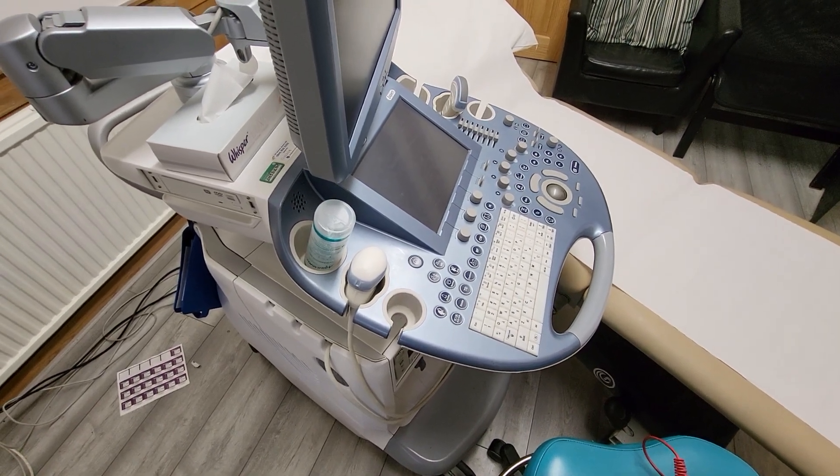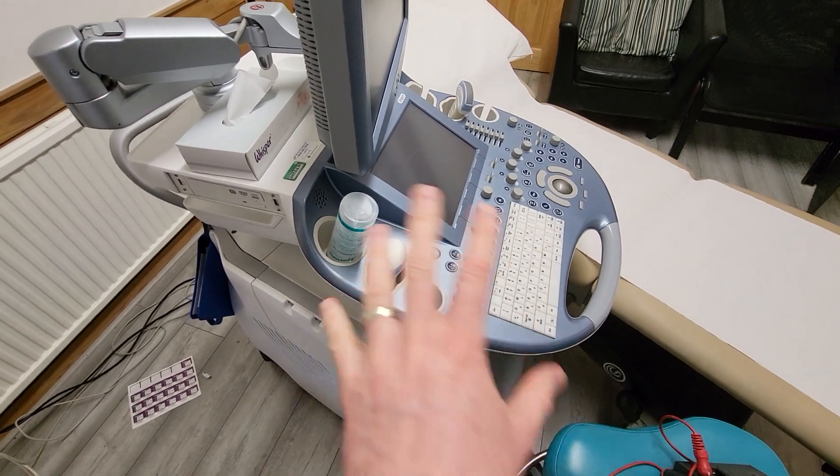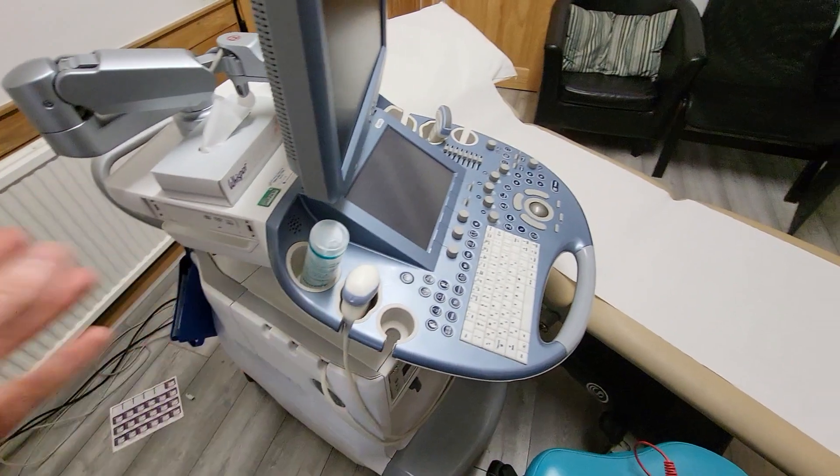Hello, Ben the PAT Tester here. Just a quick one about medical equipment. Some of you might come across medical equipment as you go around PAT Testing — we're in an ultrasound clinic today.